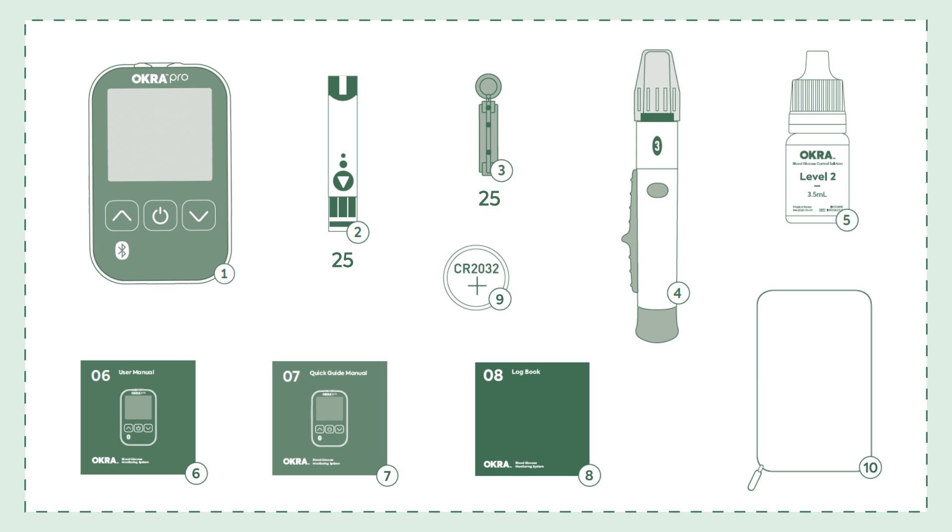Your starter kit should include an OkraPro meter, 25 test strips, 25 lancets, a lancing device, level 2 OkraPro control solution, user manual, a quick guide manual, logbook, battery, and a carrying case.